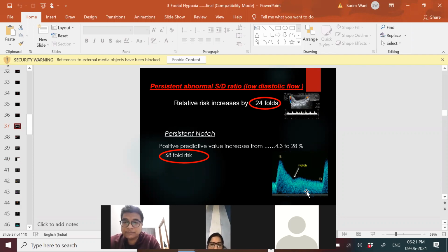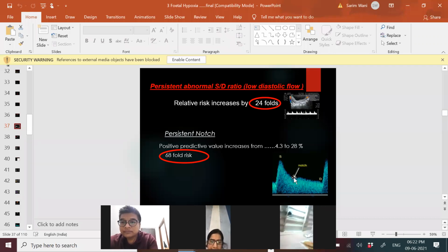Yes, sir. Others can comment in the comment box. So please repeat your question. Okay, I am repeating the question. For the sake of argument, I take that the resistive index of this uterine artery is 0.55.